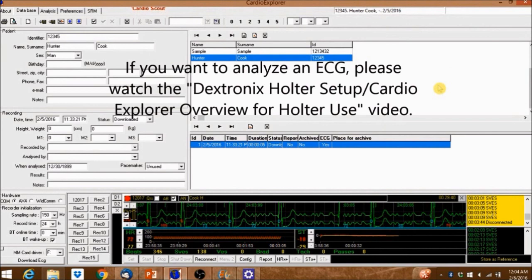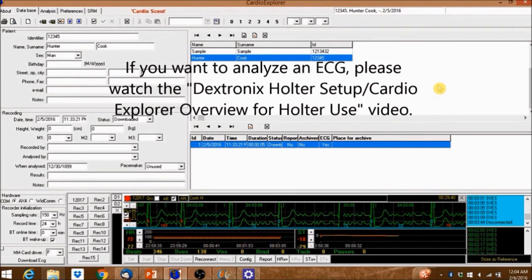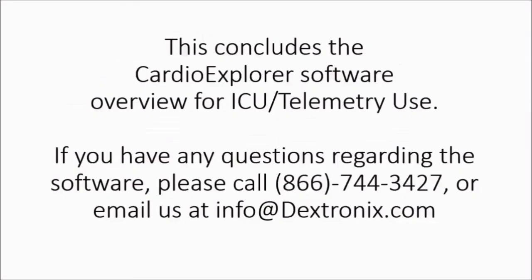If you want to analyze an ECG please watch the Dextronics Holter Setup slash Cardio Explorer Overview for Holter Use video. This concludes the Cardio Explorer software overview for ICU telemetry use. If you have any questions regarding the software please feel free to contact us.